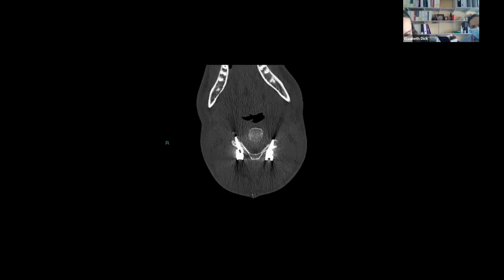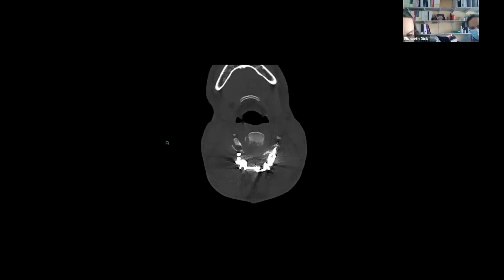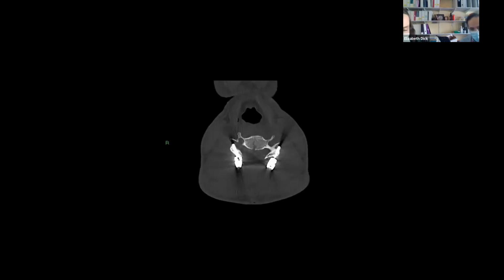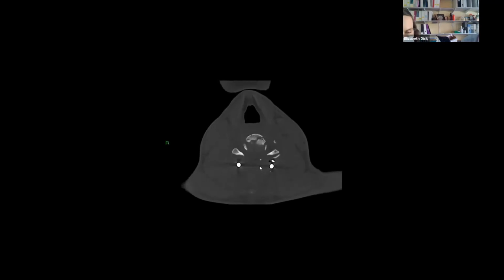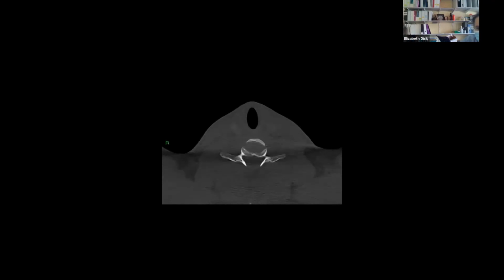And then we can see the same on axial imaging as we come through. Here we are. This is the level of C4, I think, and then C5 is here. And the screws in general, what do we think about the position of the screws here? Well, the starting point for all those screws is good, but unfortunately, they're all too low. There are 8 screws there, and probably at least 6 of them are too low, so they end up in the joint rather than in the lateral mass where they belong. And again, because it started off too low, it ends up in a neural foramen in multiple places. So you have to question the stability of the implant itself. I don't think there are many complimentary words you can say about that fixation.